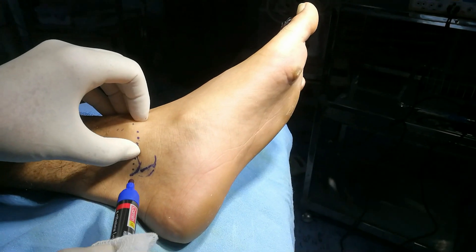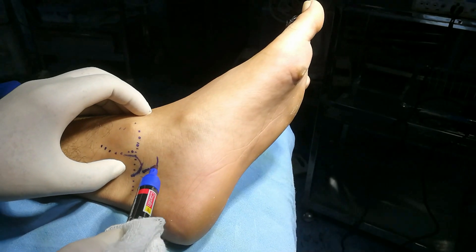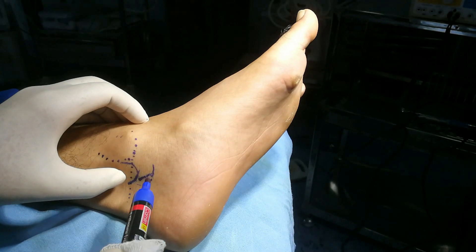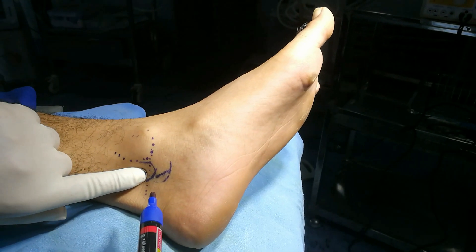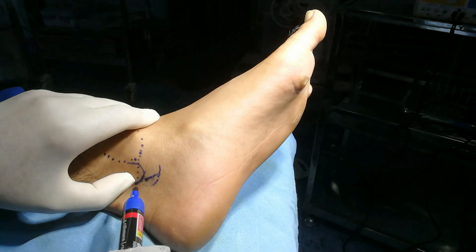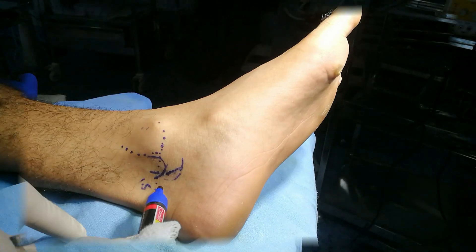So here this is the reference point and the puncture point is at these two locations: 1 finger-breadth down, or you can say 1.5 cm inferiorly and 1.5 cm anteriorly. Here you can palpate the posterior tibial artery and the entry point is on either side of this artery.